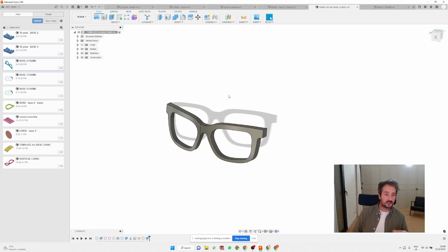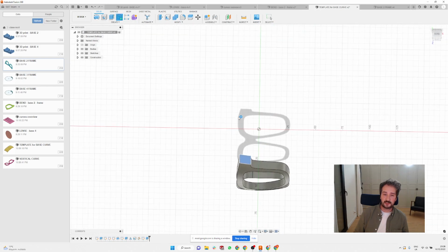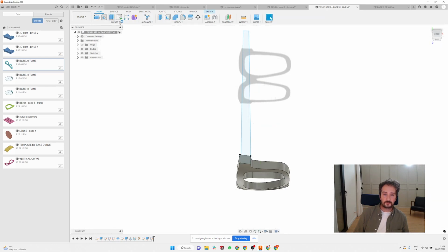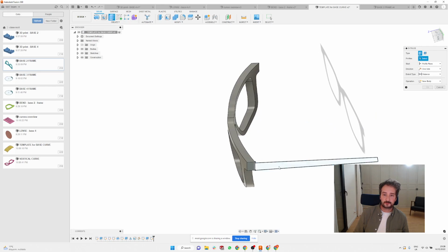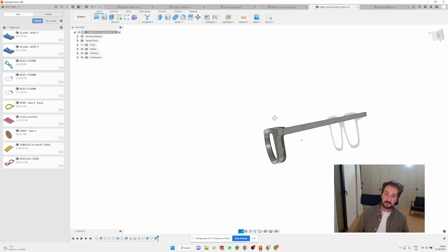I wanted to figure out how to do this, not mostly because I want to use it every time, but literally if I make the frame for somebody and I want to show them the visualization of how the frame looks, it looks much better when it has at least some base curve, and you can quickly add some sides, because if you have it like this, you can create a sketch on this side and you can create some arms here. And it will look much closer to your frame afterwards. It's not perfect, but it can help you to play with this.